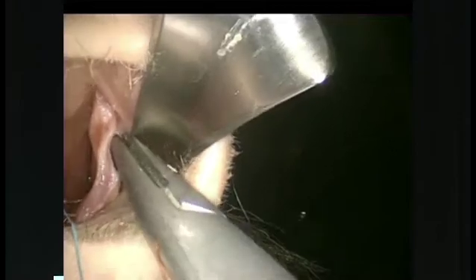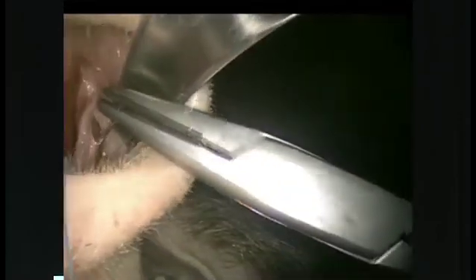So the stent or the device itself is Ethibond suture harnessed to a specialized nasal valve splint. And we're passing the needle end of the device through the upper lateral cartilage. You've got to get a good bulky bite. Make sure that goes through. And you can see it's fairly part of our skill set as nasal surgeons to be able to do this using a speculum. There's the device with a slit and a hole on the end, and I'm passing the needle back through the device.